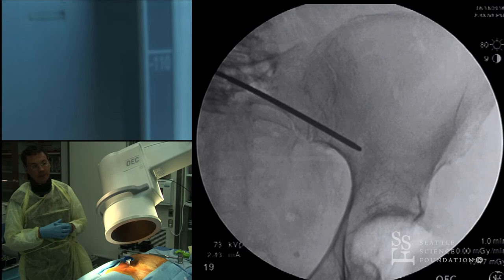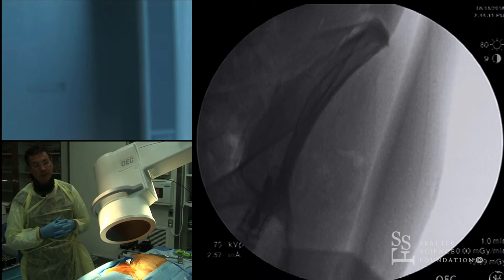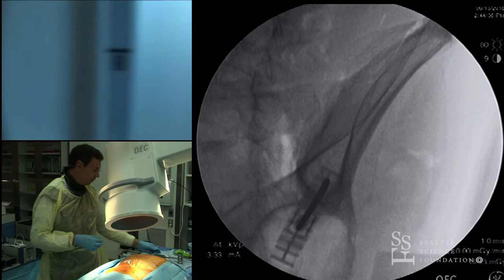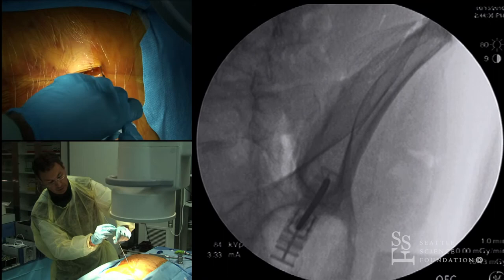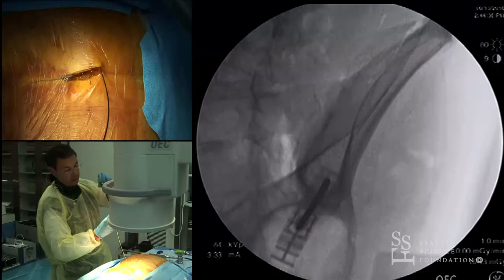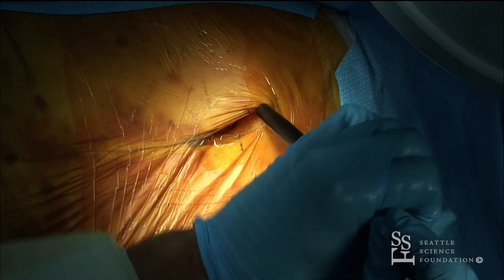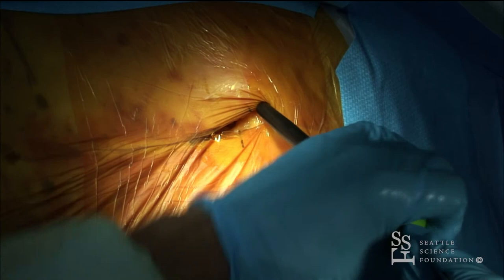It's easy to know when you're breaking lateral with the Jamshidi needle because you feel resistance. You want the mallet to move smoothly as you advance the needle into the iliac. The tip is inside and contained. Now put the guide wire in. Use it to feel and make sure you don't encounter anything soft. Then take the guide wire out and use the tap — tapping is important as in the open techniques, because you can break a lot of screws. Work your way to be a little more medial, lifting your hand to correct the medial angulation.